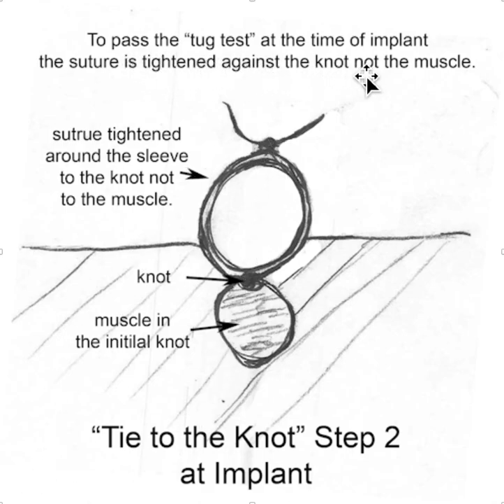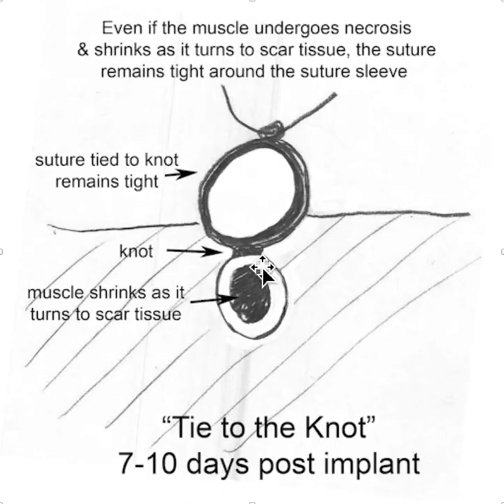To pass the tug test with this approach, the suture is tightened not against the muscle, but against this knot. There's less likelihood for the muscle to undergo necrosis. However, even if it does undergo necrosis and turn to fibrous tissue, it really doesn't matter. Here we have a circumstance where the muscle turned to fibrous tissue, it shrunk, and now it's a little bit loose here, but the suture sleeve, which is tied directly to the knot, is still tight on the lead.